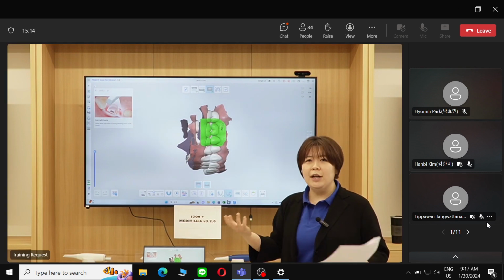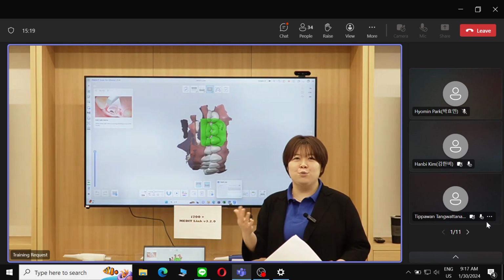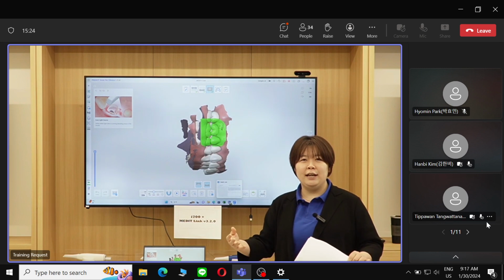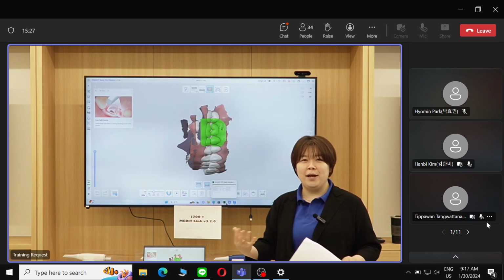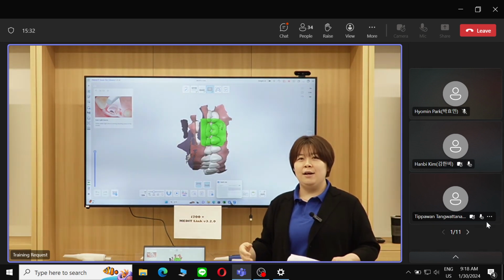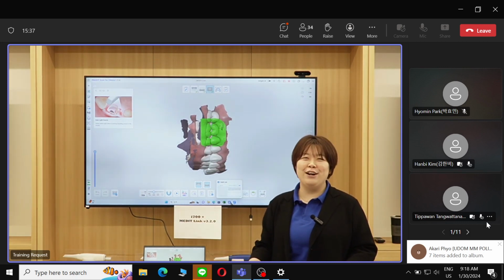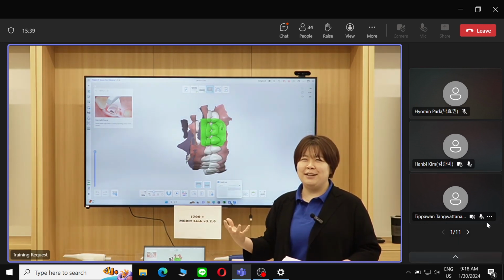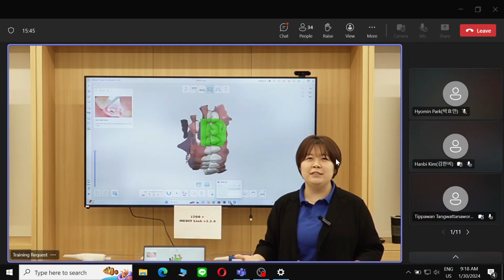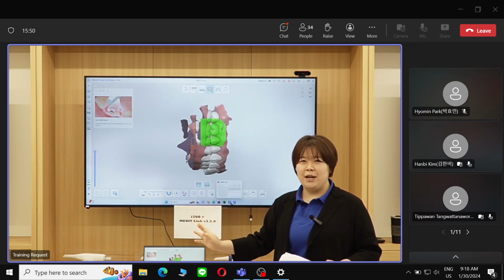And okay, so one more thing, I wasn't really planning on talking about, but I think it's worth mentioning. Medit has been getting attacks from our competitors in recent times, especially from minor class intraoral scanner companies. We're not going to name who they are, but we think you know who they are. So it seems that they're trying to create some noise or fabricate an issue. And so recently we've been hearing this in the field, people saying, oh, with MEDIT scanners, there's a danger of getting double layered data.